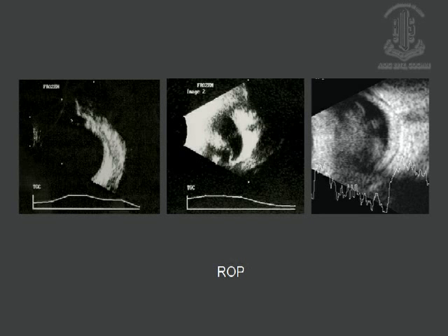Patients with ROP, ultrasound has some role in determining your surgical steps, because whether surgery is feasible or not feasible, and especially it tells you a lot about the anterior loops here and whether the posterior funnel is closed or open, because that is prognostically important as far as results are concerned.